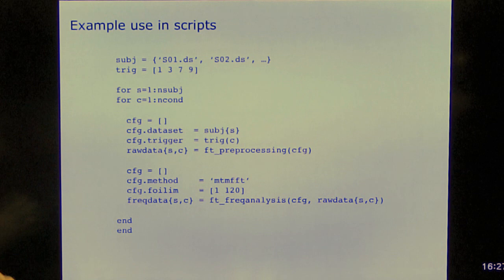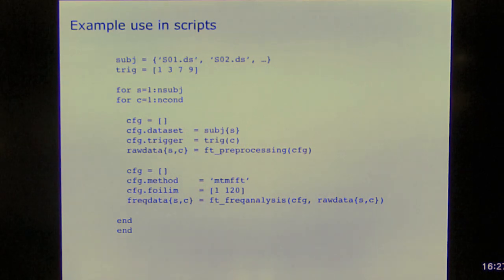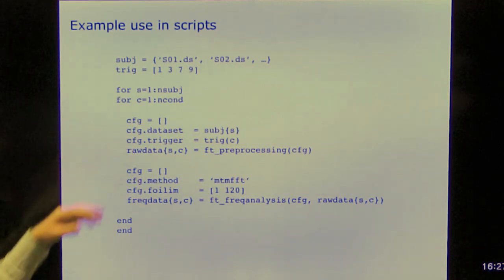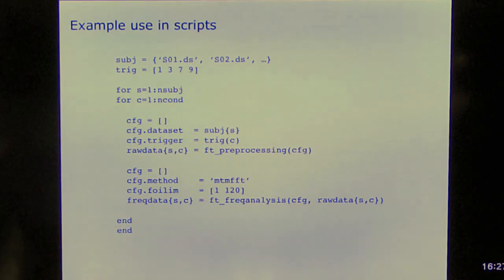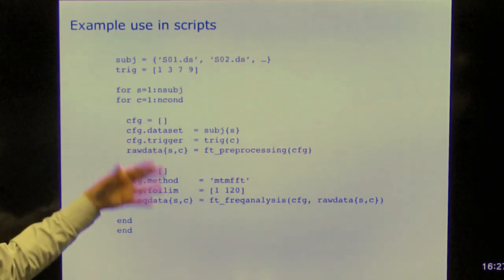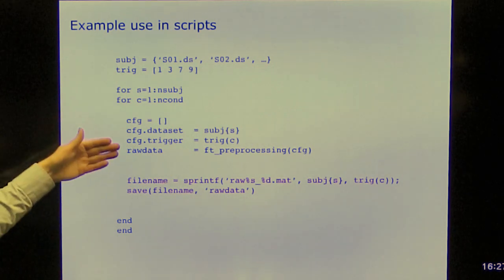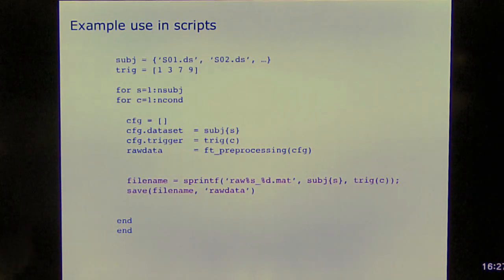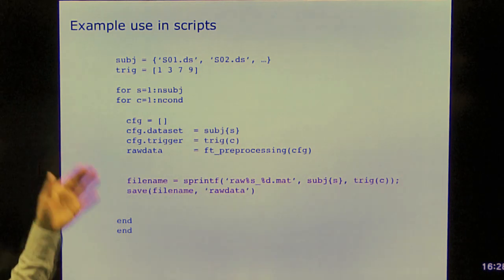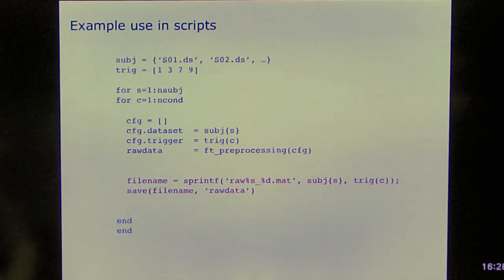This is something that you would start in the evening, and then the next morning you would find that your computer ran out of memory probably. Because what I'm doing here, I'm storing everything in the cell array, and especially with MEG data, this is large. So that means that it just doesn't fit. All of these data sets don't fit in memory. So what we typically do is we would do something like this. So we would write the data to disk and then continue with the next subject. And this would run through the night and then the next morning you would find all the files nicely on your hard disk.